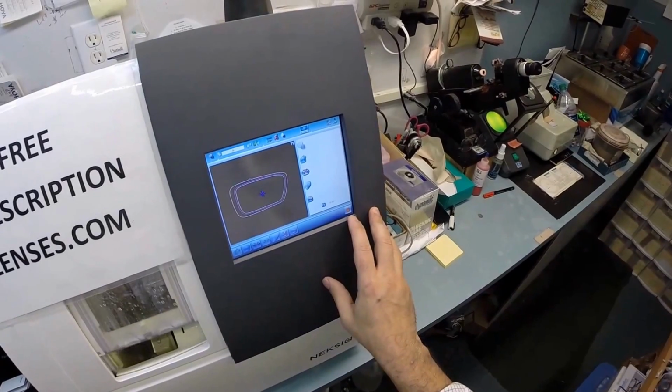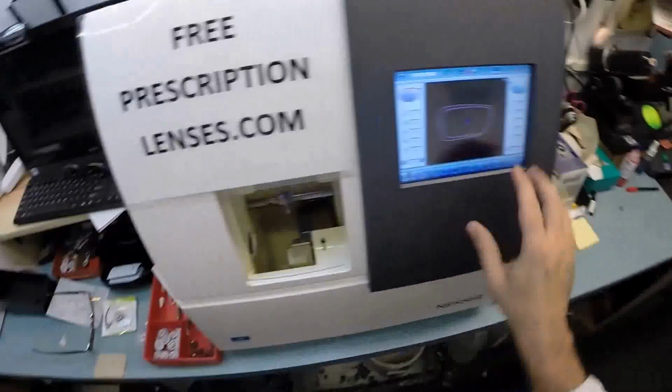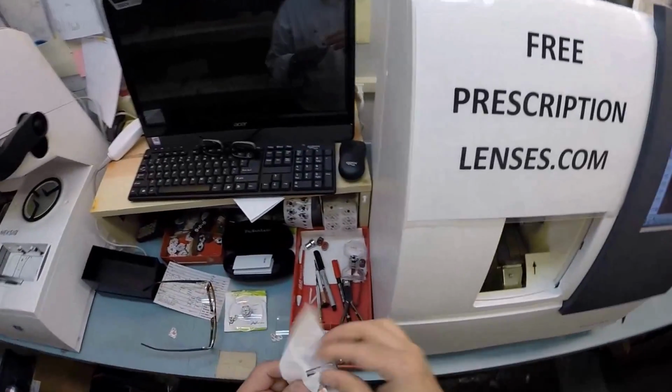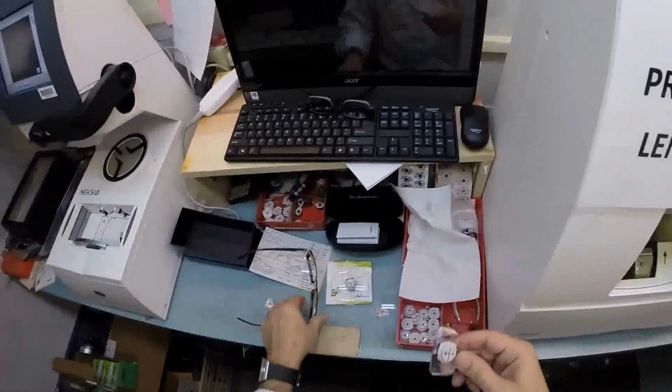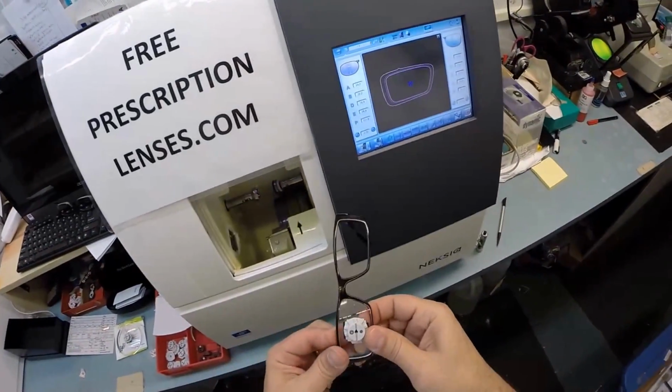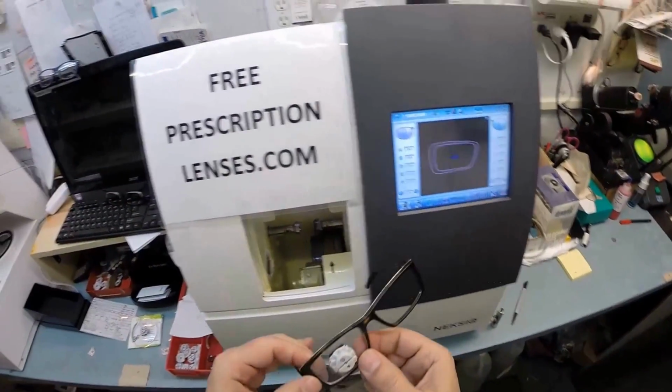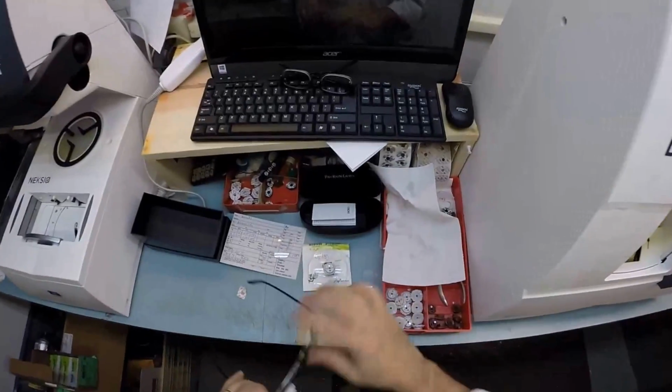We will open this door up, hit that button, take the lens out, dry it off again, and we'll see if it fits in this time. Gonna tuck it in at the outside corner, then using my thumbs, press down the nose, it snaps in perfectly. And let's go ahead and do the same thing for the left lens.